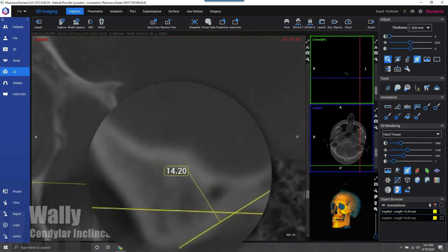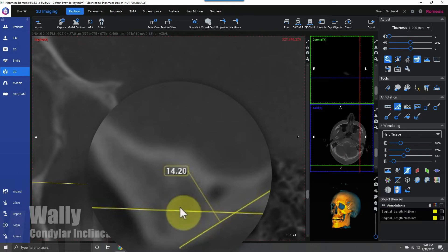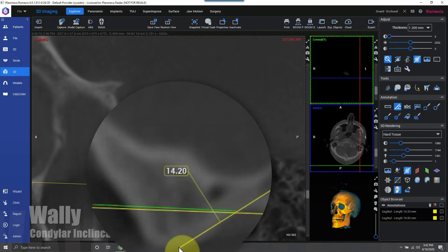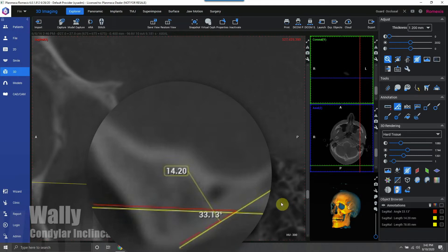So then you get this angle, and the condylar inclination is the angle that we just drew in relation to the Frankfurt horizontal plane. I'm going to go ahead and measure this angle in Romexis to get this patient's true condylar inclination, which is 33.1 degrees.